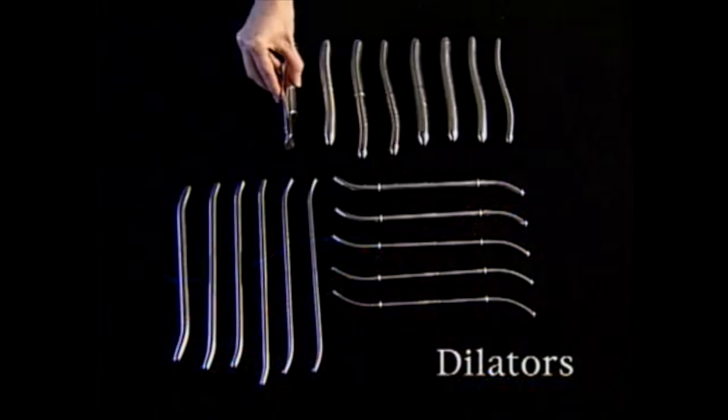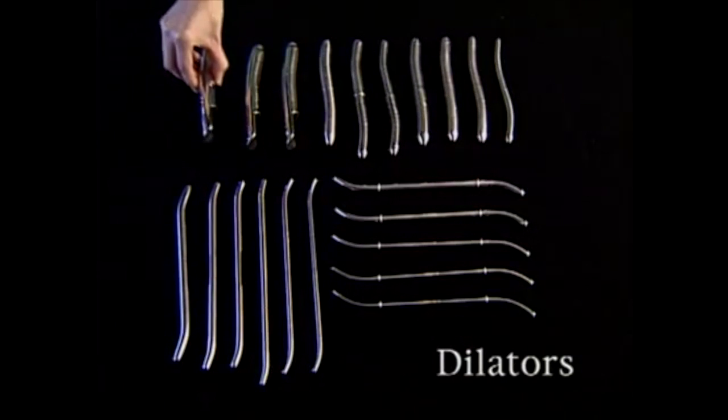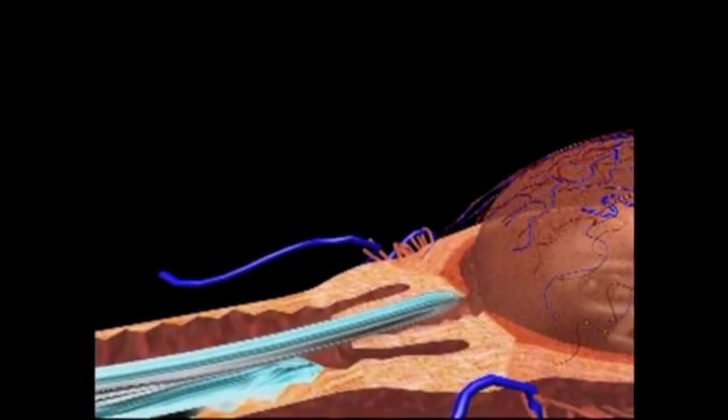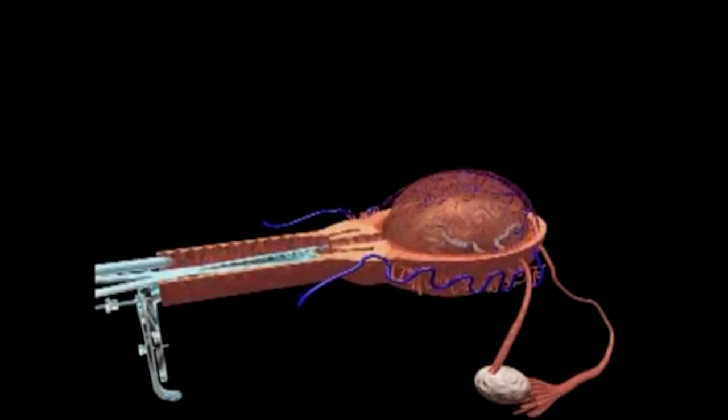In order to accommodate the instruments necessary to continue the abortion, the cervical opening is then enlarged through the use of cervical dilators. These dilators come in a range of sizes, and progressively larger ones are used to achieve greater dilation. In the procedure depicted here, 2 sizes are being used.